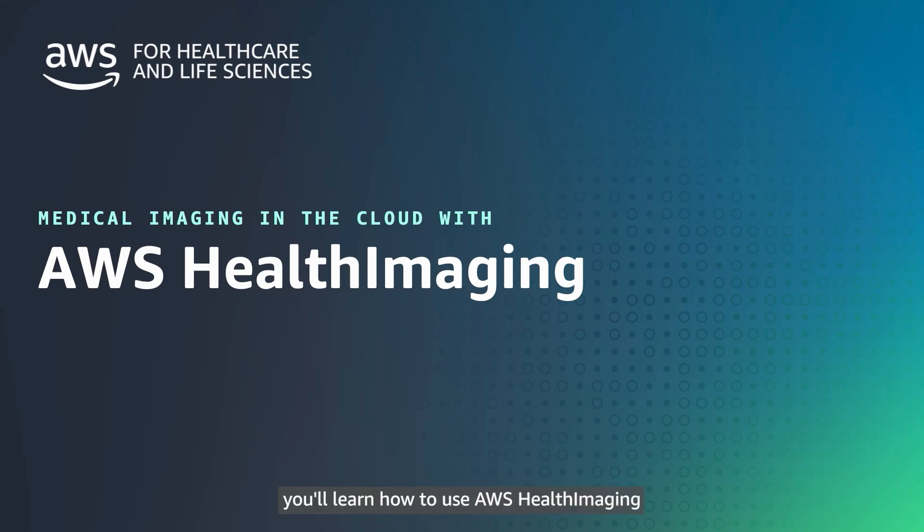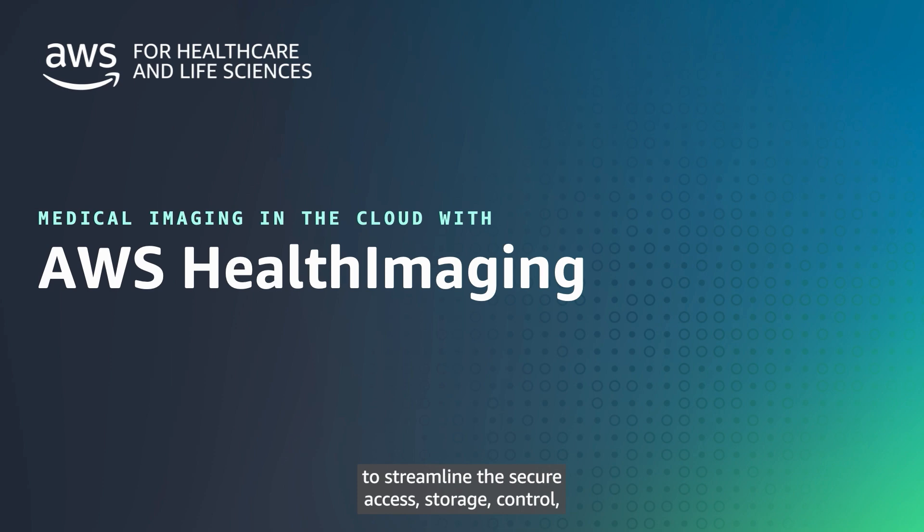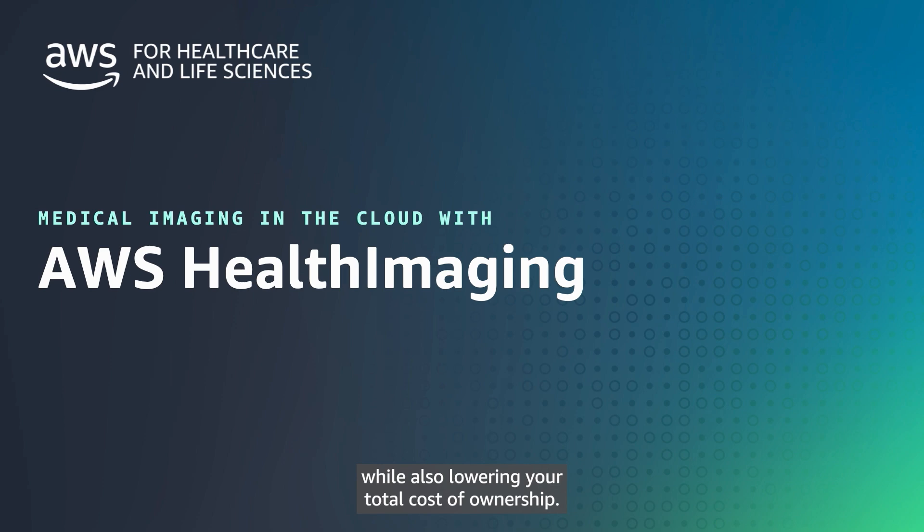In this demo, you'll learn how to use AWS Health Imaging to streamline the secure access, storage, control, and auditing of your imaging data, while also lowering your total cost of ownership.